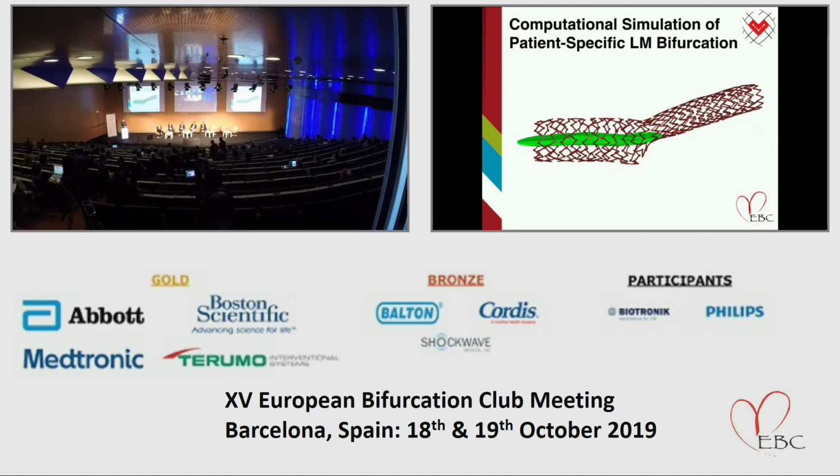So last question. Yes. Actually, the previous Synergy had 5 connectors at the end. Now they've reduced the connectors to 4, although the body of the Synergy stent had 2 connectors, which they've increased to 3. But the proximal 2 cells of Synergy initially had 5 connectors for the large vessel. Here they have decreased it to 4. Any specific reason you've decreased the connectors at the end, although you want to increase the radial strength and the axial strength of the stent?